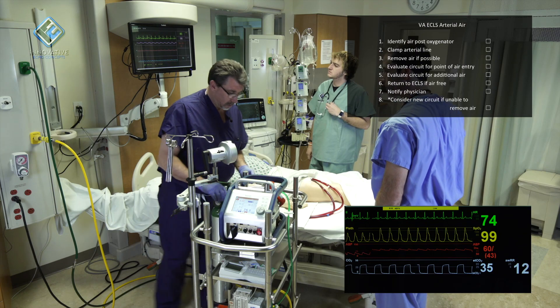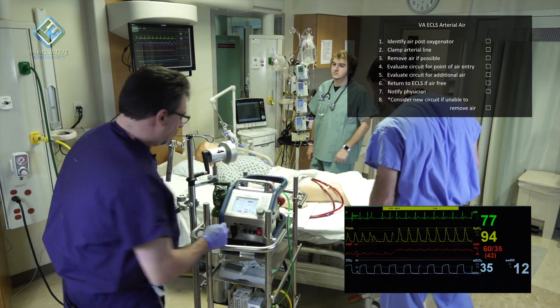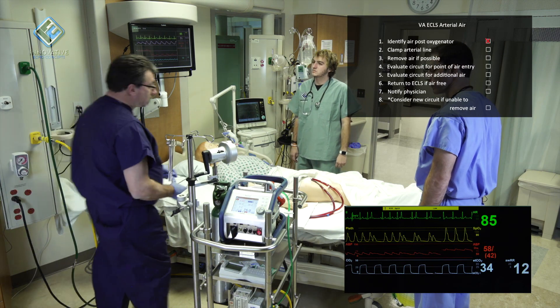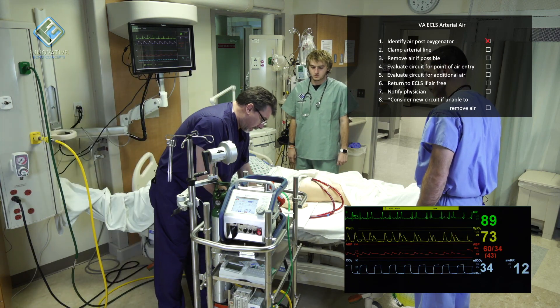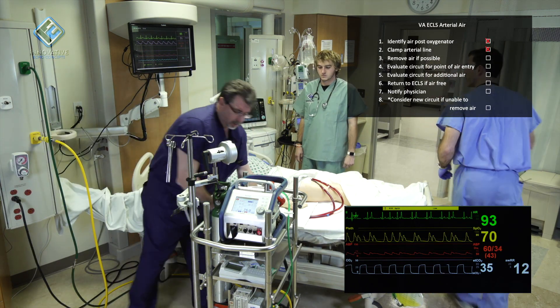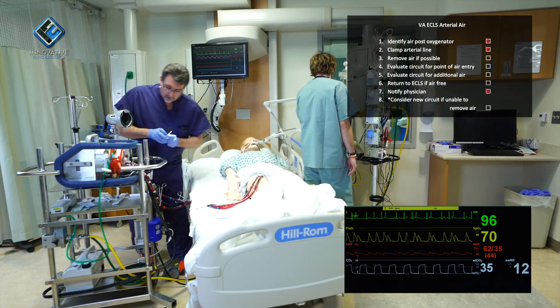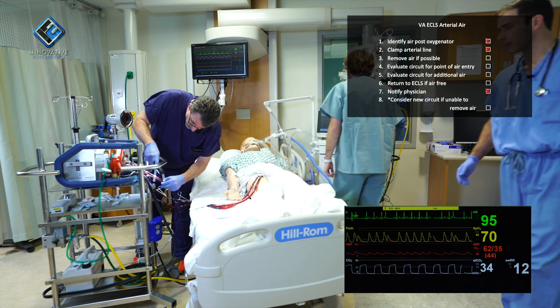Is everything okay? One second. We have an arterial bubble alarm. We are off ECLS. I'm going to clamp the arterial line. I'm going to call for help and get the doctor. Can we have some help in here? I'm going to look for the arterial bubble in the arterial line.